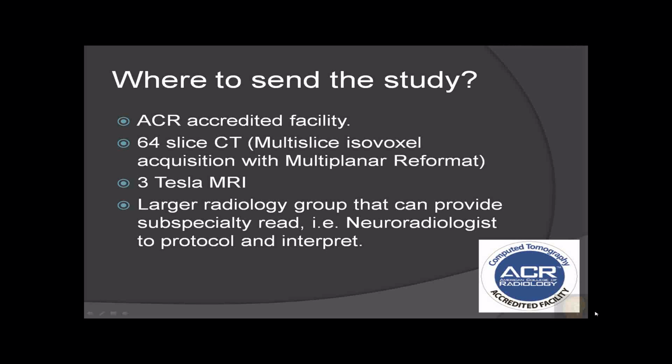That is a basic requirement nowadays for any kind of high resolution orbital images. And the same principle applies to MRI. High field MRI, 1.5 Tesla or above, is good quality. 3 Tesla MRI is very accurate and high resolution for orbital imaging.